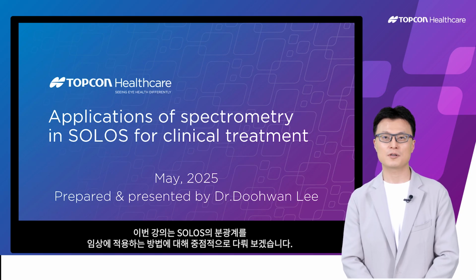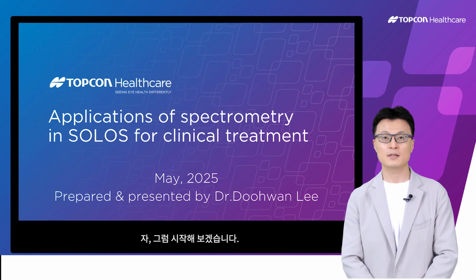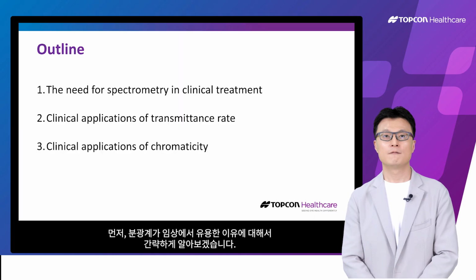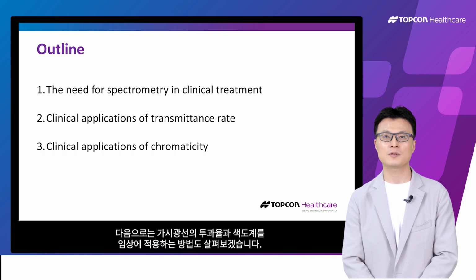This lecture will focus on how to apply the spectrometry of SOLOS in clinical practice. I believe that this lecture will be very helpful in your clinical practice. Well then, shall we get started? First, I'll briefly tell you why spectrometry is useful in clinical practice. Next, I will explore how to apply the transmission rate of visible light and chromaticity in clinical settings.